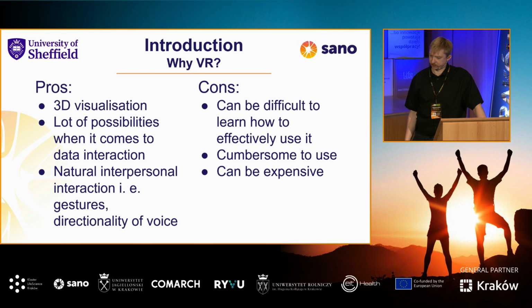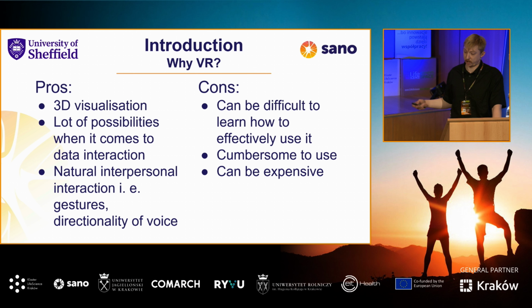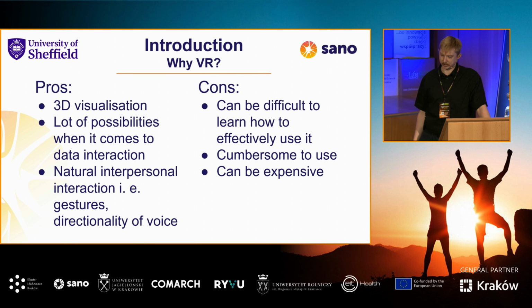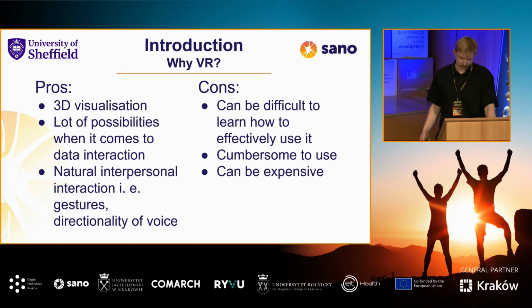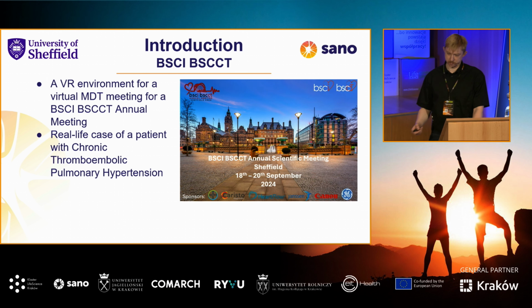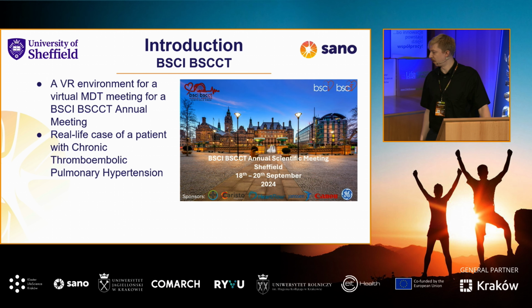But the problems are, of course, that it can be quite difficult to use. It can be cumbersome when you learn it, and can be expensive, but doesn't have to be. But also it is seen a little bit as a gimmick or a gaming device. So you have to win the trust of the clinicians. So how do you do that? You try to present to them that it is usable on real-life cases.